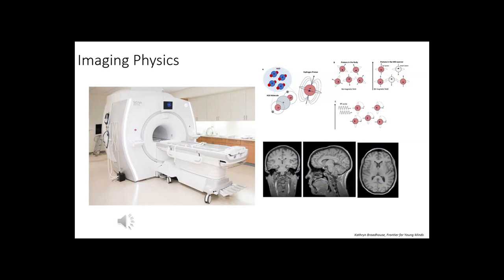Some are white matter, some are gray matter. So what is gray matter? We call it gray matter because the intensity in the MR is in the gray area. This is neurons, which are very, very important. The stuff in the middle is bright, close to white color, so we call it white matter. So what is the white matter?